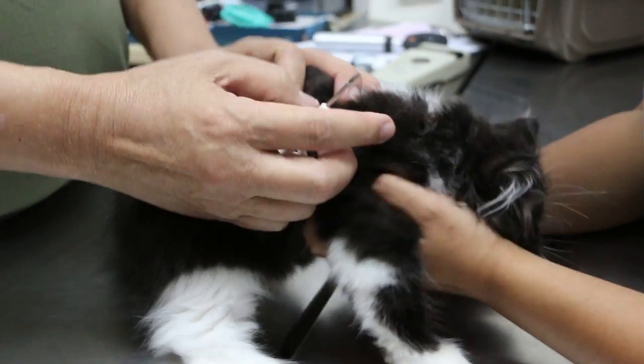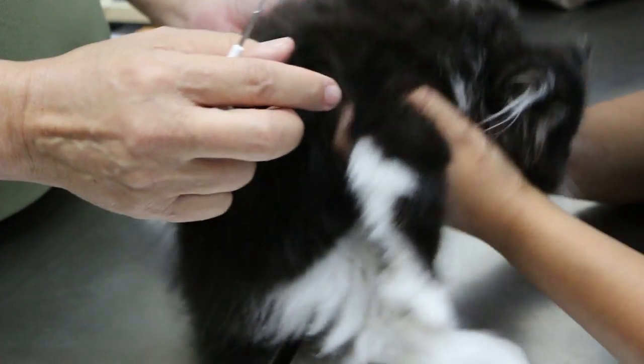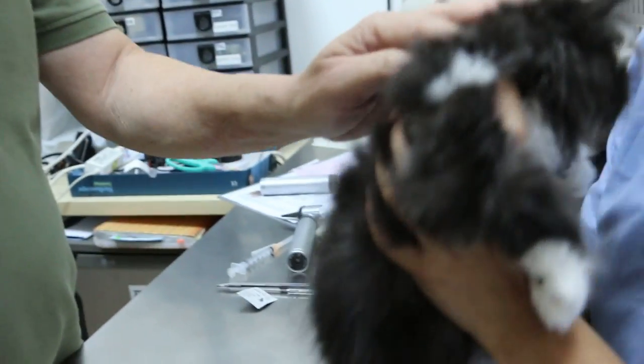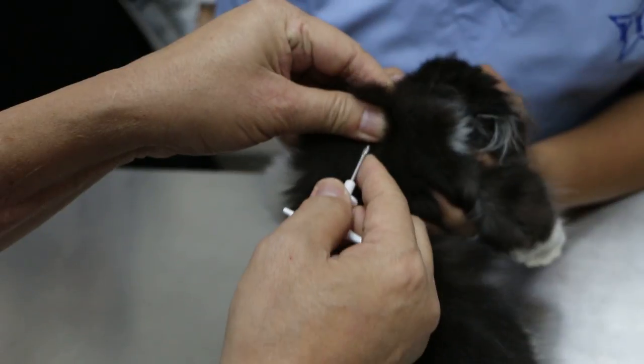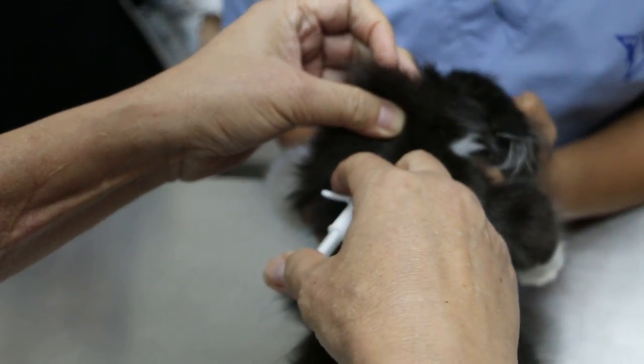So now this is to show the videoing. Video the microchip. Just some vaccination was done. So hold on. Just now let you hold. Normally. Okay. Spin out. No, your head. Don't put down your head. This kitten seems to be very good.